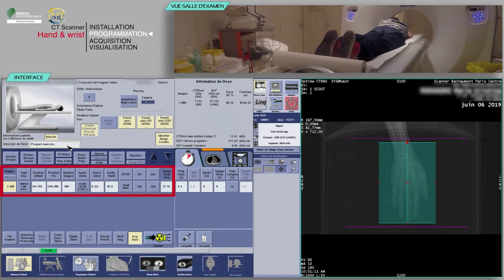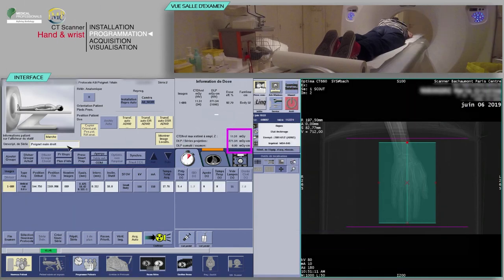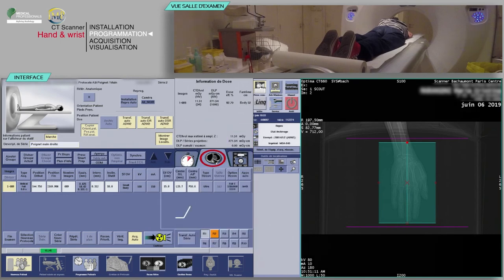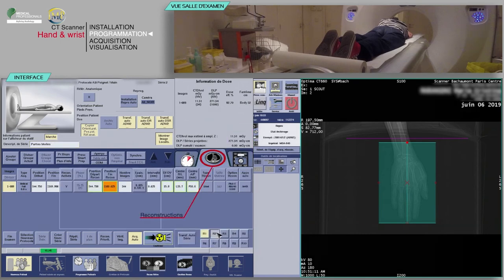Check the consistency of the acquisition parameters, which are often pre-configured. Before continuing, check that the predicted dose is consistent with the diagnostic guideline values. Check the reconstruction boxes.